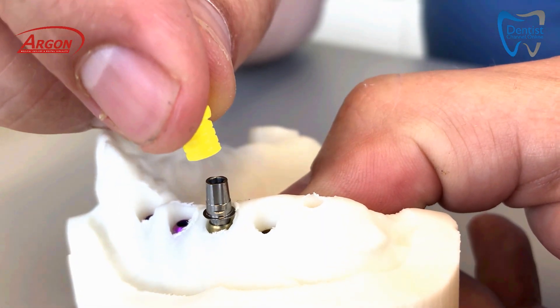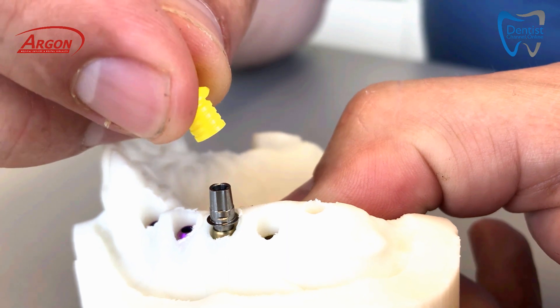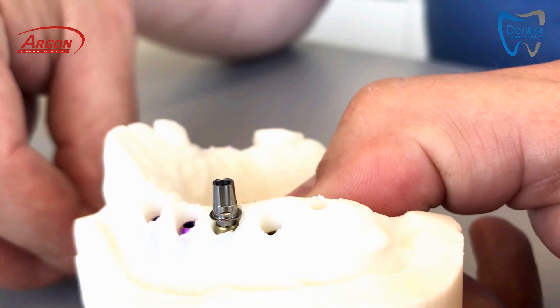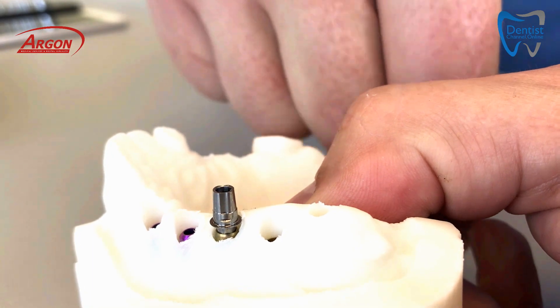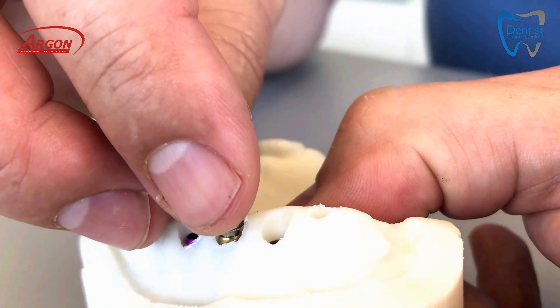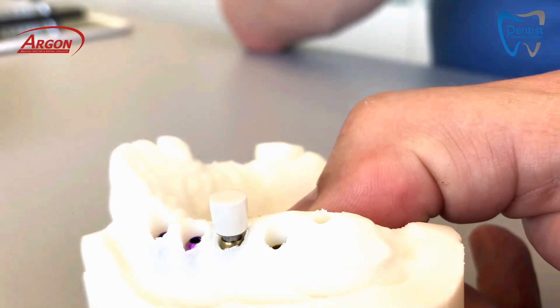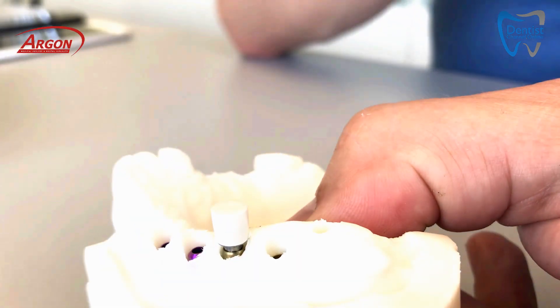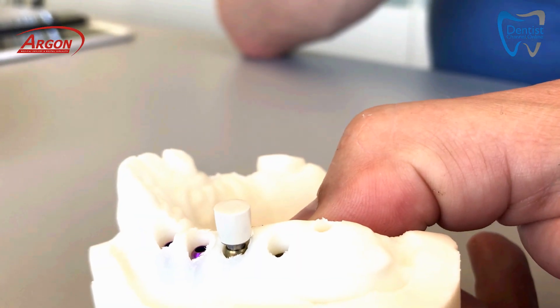You then remove the impression and leave the abutment as it is. Instead of a gingiva former, you can place a healing cap. We have pre-manufactured healing caps, and the patient can rest with it in the mouth.